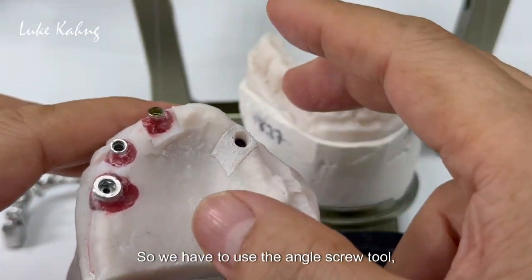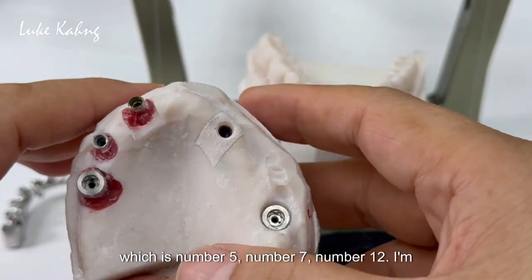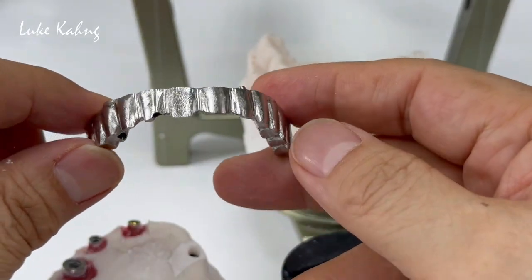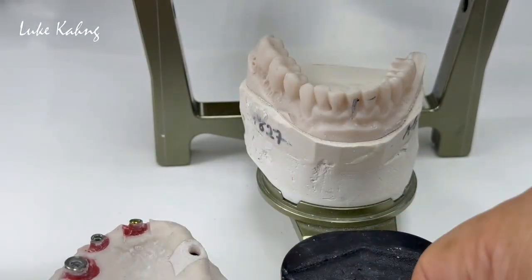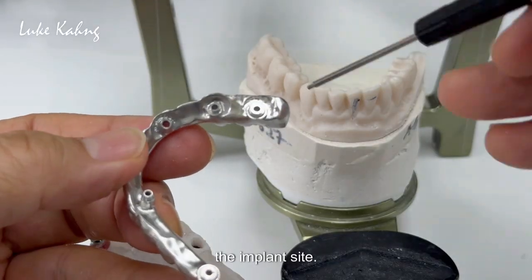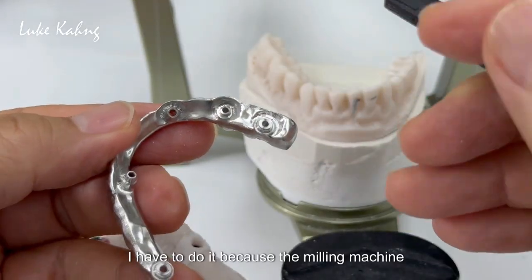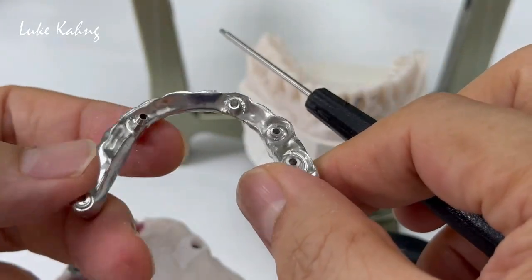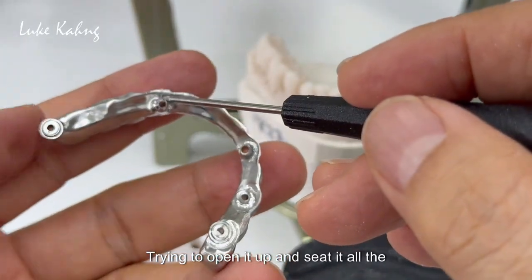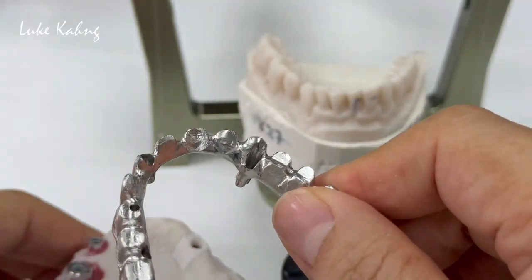We have to use the angle screw tool — which is number five, number seven, number 12 — so it's really hard to get the final finish work, especially underneath the implant site. We're trying to do this manually; I have to do it because the milling machine cannot do it. It's very very tricky trying to open it up to seat it all the way down. Finally we did it.